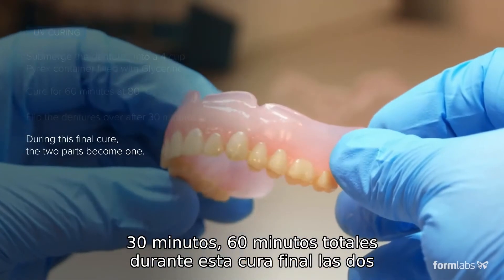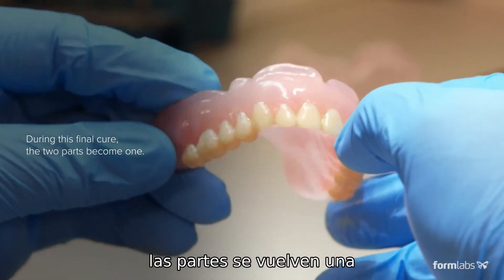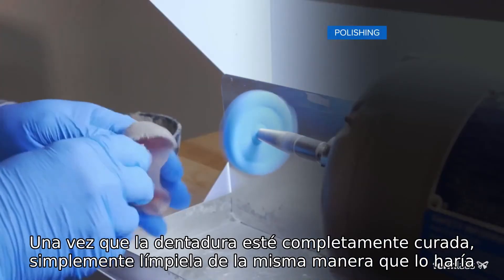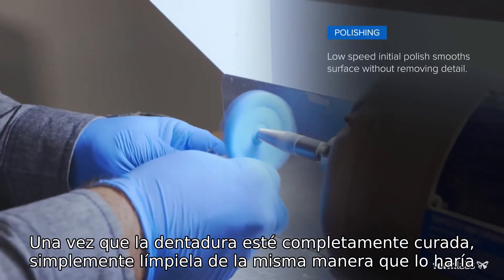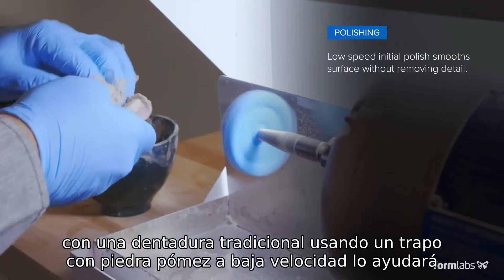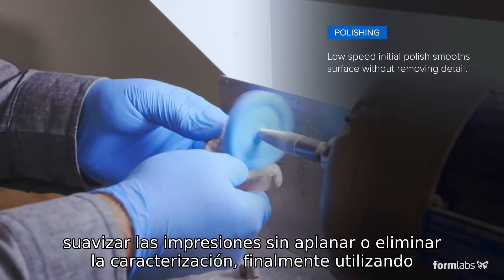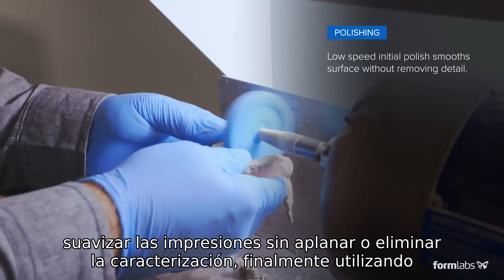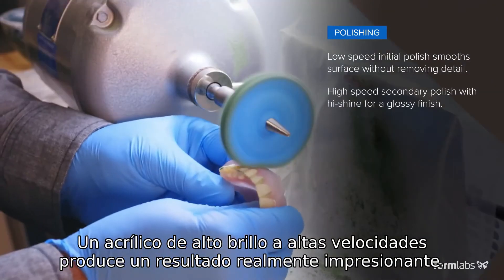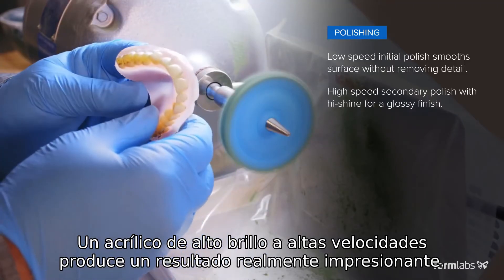During this final cure, the two parts become one. Once the denture is fully cured, simply polish it the same way you would a traditional denture. Using a rag wheel with pumice at low speeds will help smooth the prints without flattening or removing characterization. Finally, using an acrylic high shine at high speeds yields a truly impressive result.